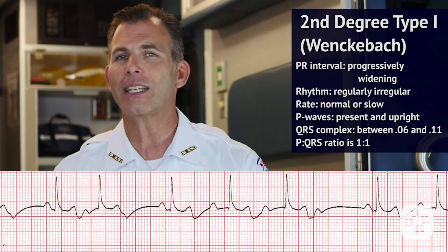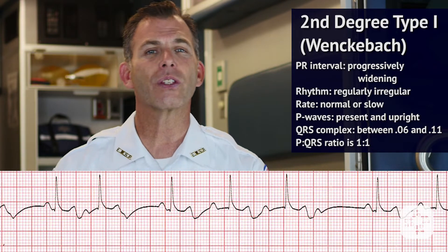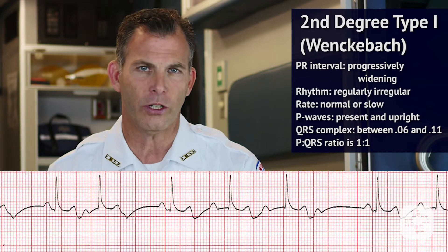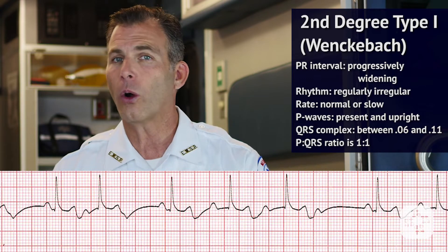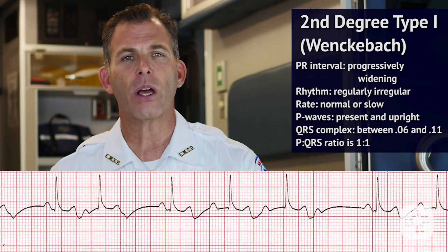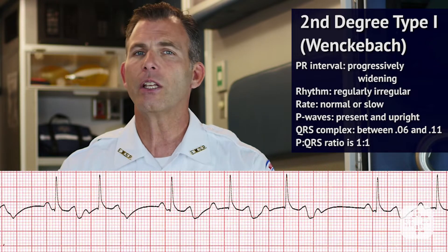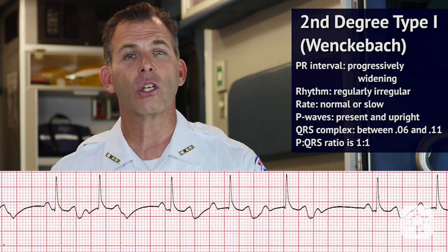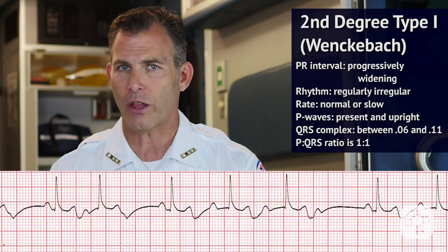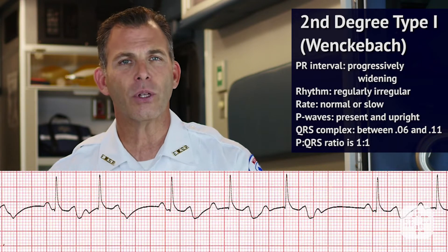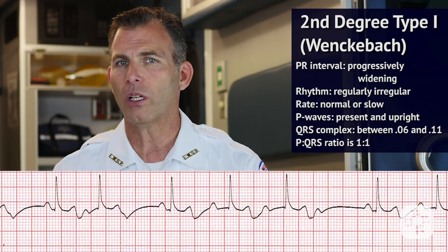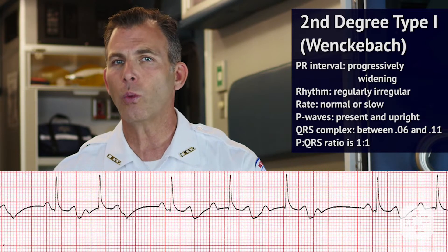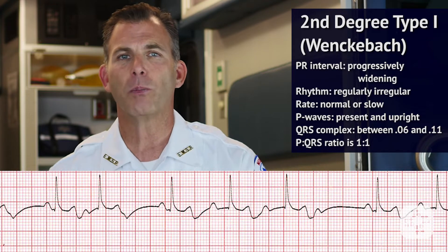In interpreting this ECG, we see that the rhythm with this type of second degree block is regularly irregular. The rate is normal or slow and P waves are present and upright. The P to R interval is progressively lengthening until a QRS complex is dropped altogether. The QRS complex is between .06 and .11 seconds and the P wave to QRS ratio is 1 to 1 until a P wave is blocked.